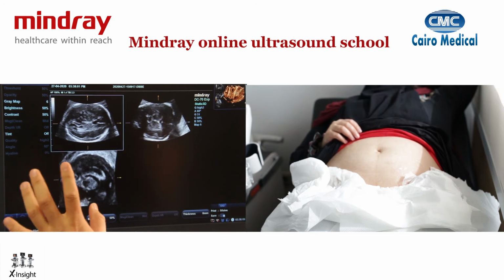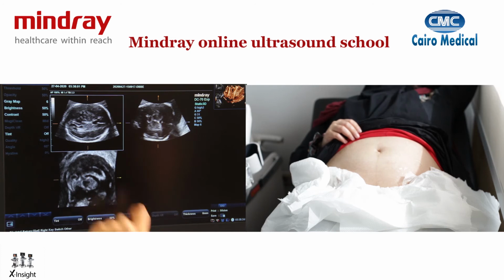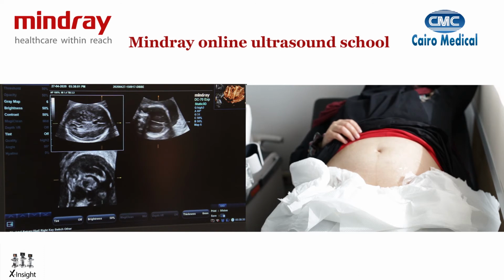And we know, when we described in the lecture, that the junction of the 3 planes that we use in the 3D is this point here, and this is our point of interest. So I can actually move across this point of interest to see what I want. So if I want to see the anterior structures of the brain, and I get close, I can actually see here the eyes. If I keep going back across the midline, then I can see more of the fetal brain. And if I keep going back toward the posterior fossa of the brain, then I can actually see the cerebellum and the other structures here.